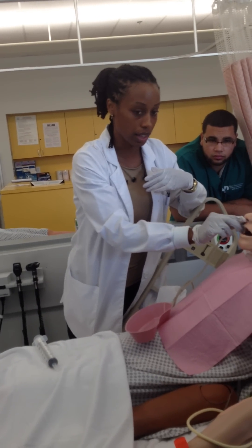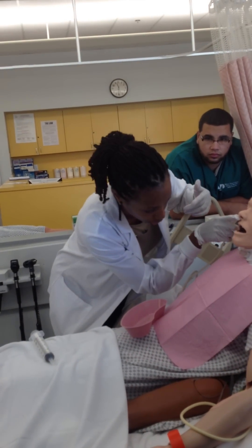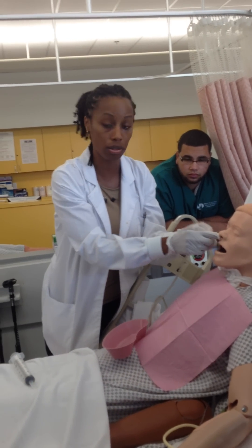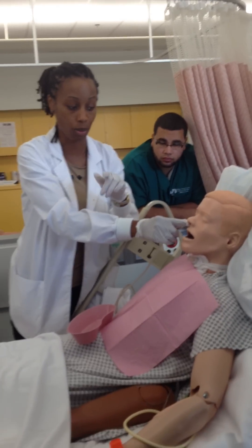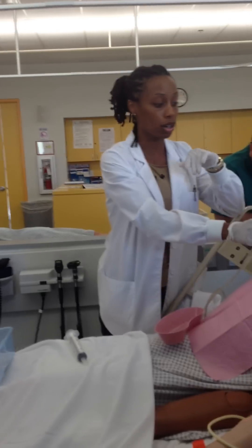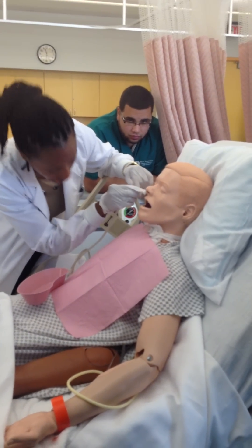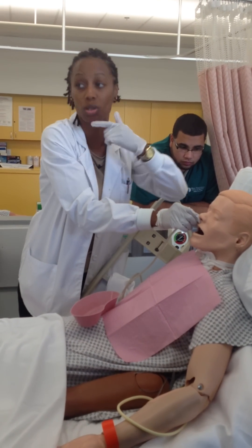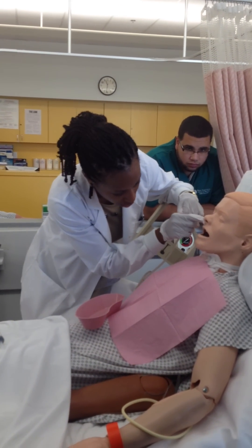If you're going in and they tell you they feel like they're choking, like they can't breathe, you want to look in their mouth because it can coil in the back of their throat. If so, just pull it out — not all the way, because once you get it in you want to keep it in. If they pull it out completely, just say okay, bear with me, I'm going to go again. They're going to be coughing and gagging because you're still near the gag reflex — it's just coiled around it. You can see where you're going even in mannequins, and you can use a pen light.